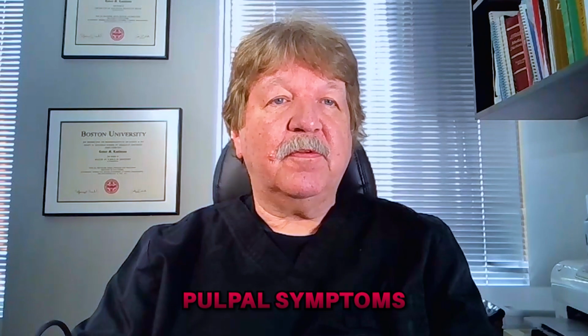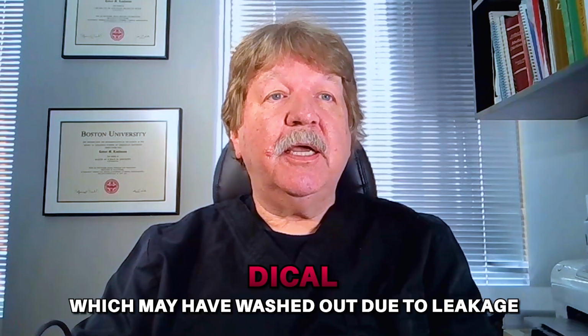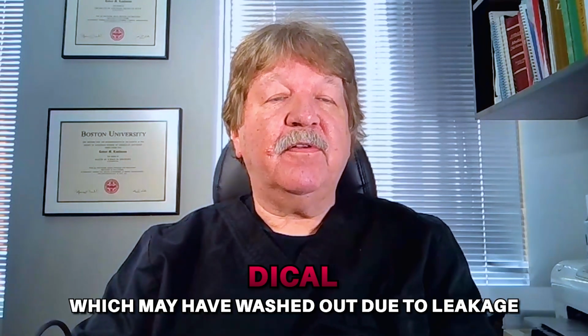In certain teeth, we suspect that restorative materials or pulp caps may have caused pulpal symptoms. The extent and proximity of these materials to the pulp can sometimes give us a clue as to where the chamber or orifice may be if we suspect a previous exposure has occurred. Pulp protective agents such as Dycal, which may have washed out due to leakage, can also help guide us to an initial entrance into the chamber.